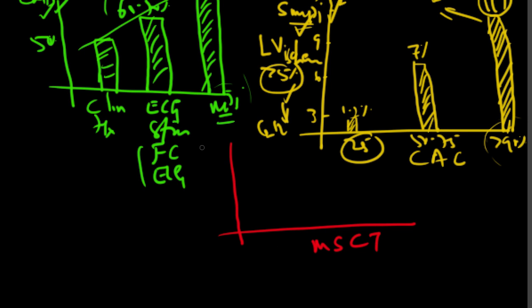So when you look at this study here, where you have multi-slice CT, for instance, performed in patients with suspected CAD, and you try to correlate against stress MPI, which was significantly positive. What percentage of these patients who have multi-slice CT actually have significant MPI?